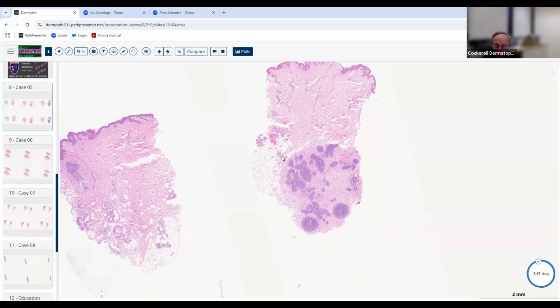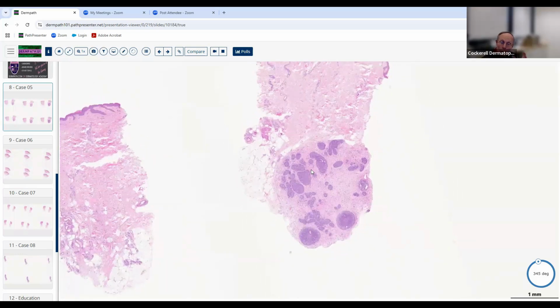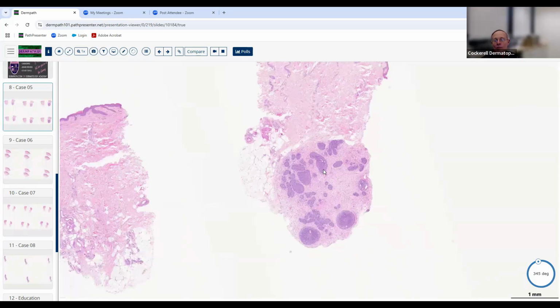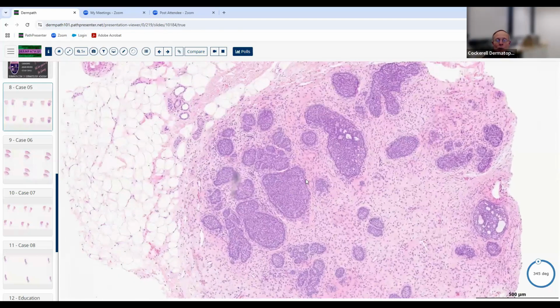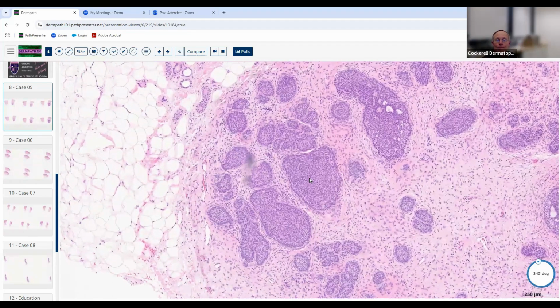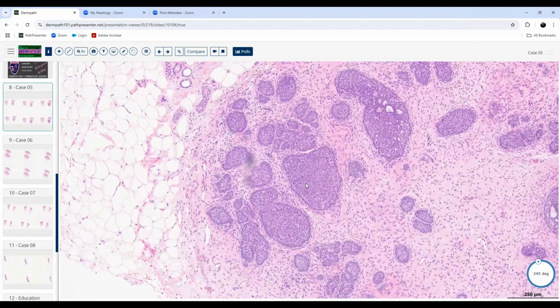And it's small, it's well circumscribed, and it's got mostly stroma, so it's going to feel kind of firm, I would imagine. And then you look at it and say, well, okay, we think it's neoplastic, and you said it's epithelial, and you said what kind of epithelium you think it is, which is basaloid. And we have really multiple different potential basaloid kinds of cells. Which kind of basaloid cell do you think we're dealing with here? Let's see here.